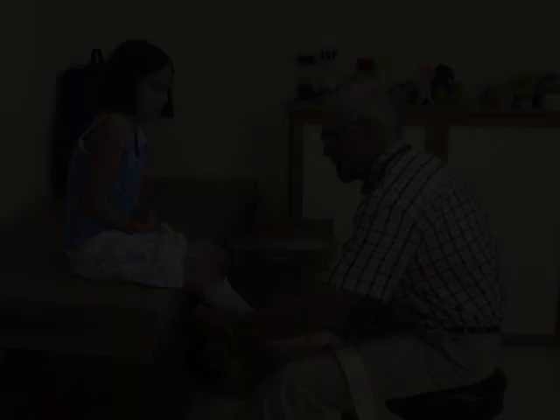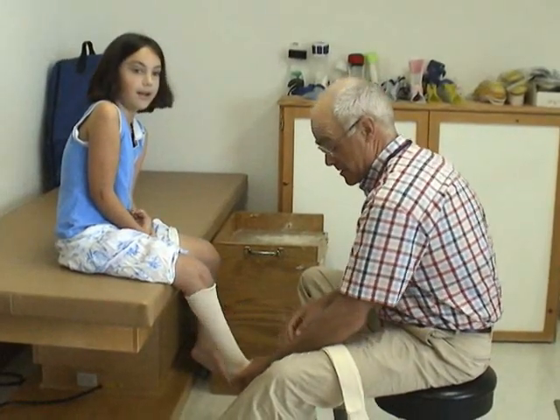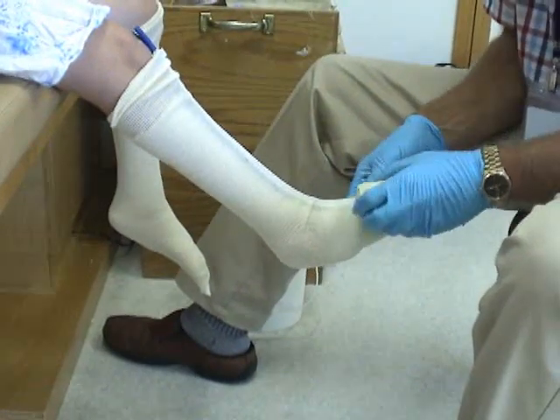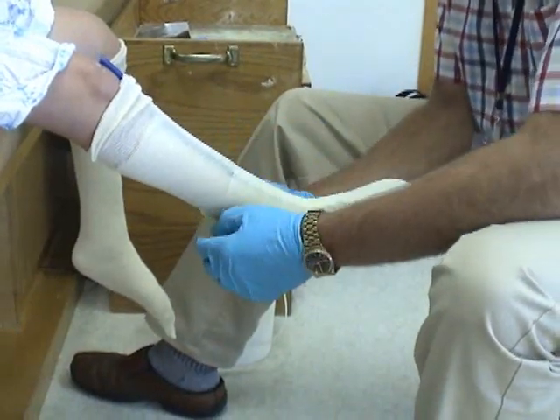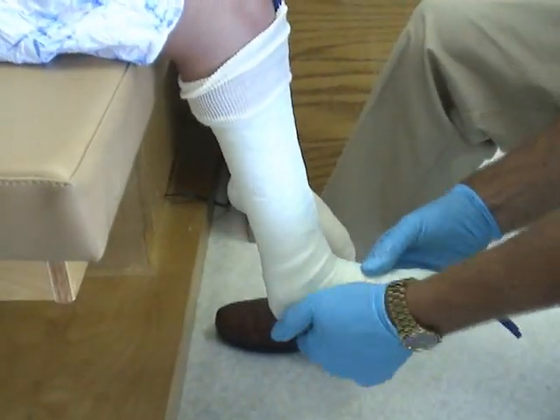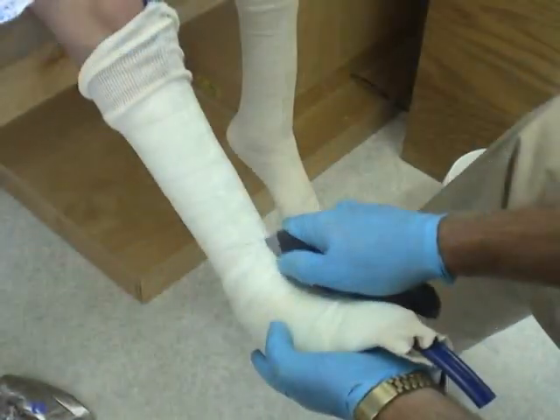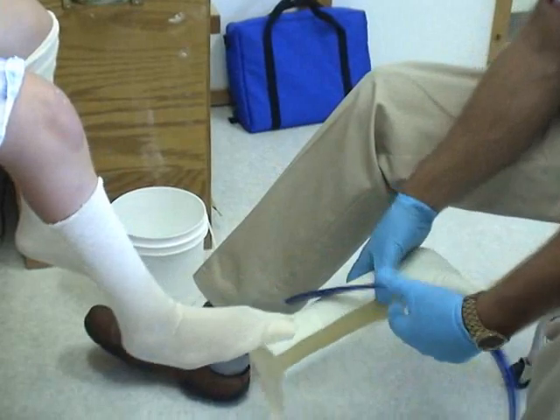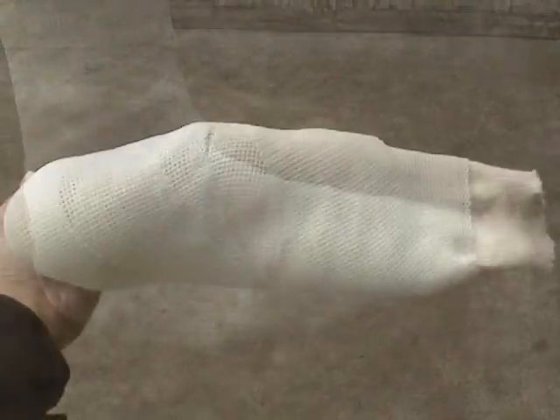She has outgrown her current braces and this process we'll watch today is to replace the braces with another set of similar style. Casting Maya is fairly straightforward, except that because her foot is not fully correctable we will not use the cascade foot plates. I've simply casted her without a foot plate and held her foot carefully with my hands. All in all, the casting is a fairly accurate representation of Maya's foot after I have imparted as much manual correction to her foot position as she can comfortably tolerate.